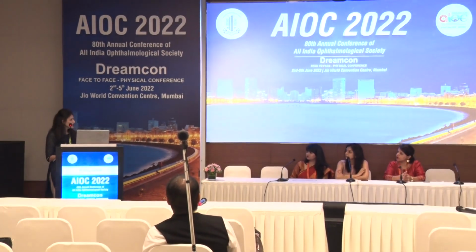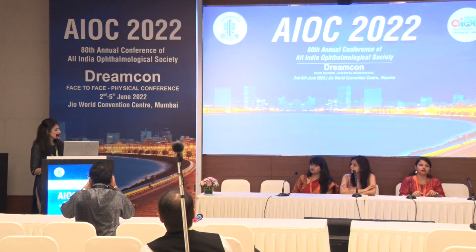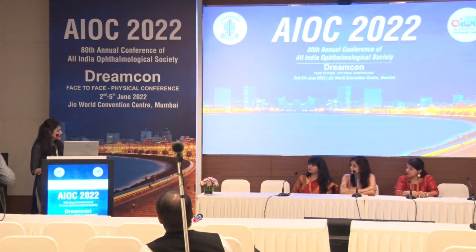Okay. So the most important thing is, toric IOLs in keratoconus are, especially in advanced keratoconus, function primarily to debulk the astigmatism. We are never attempting to completely correct the astigmatism, particularly if it's a high astigmatism. But yes, you can debulk. It also depends upon if at all the patient has been a chronic scleral contact lens user and has been happy with it, then you can probably debulk the astigmatism to some extent, and for the rest of the remaining residual astigmatism, he can continue using the scleral contact lenses.